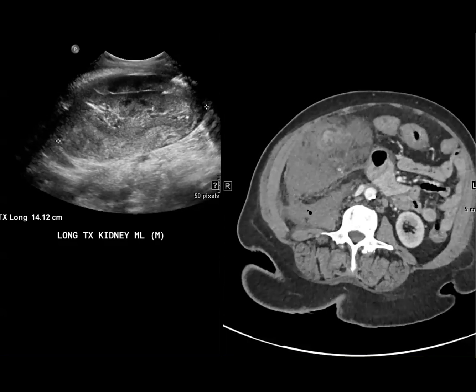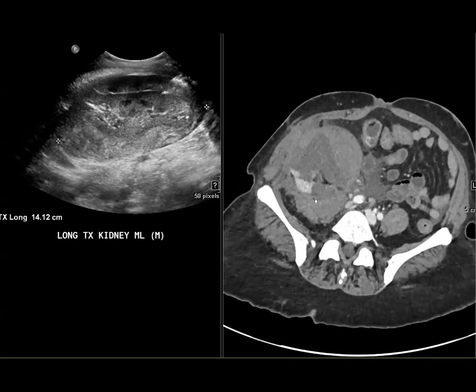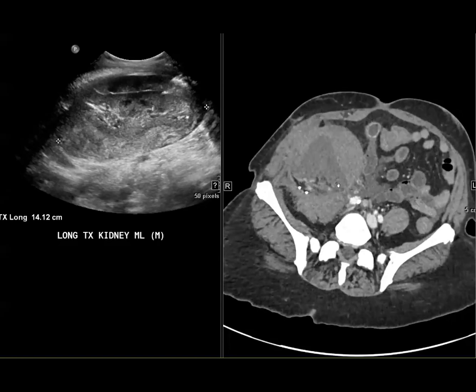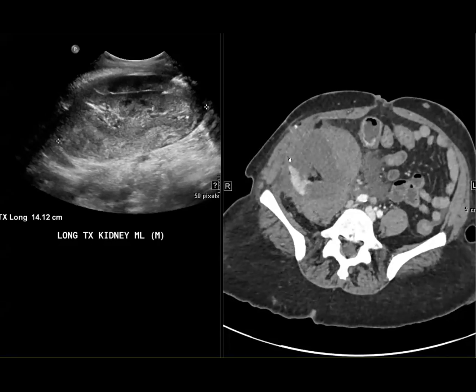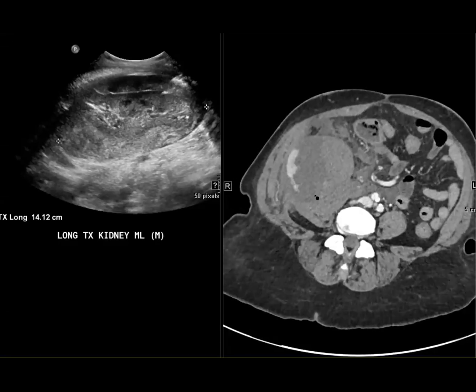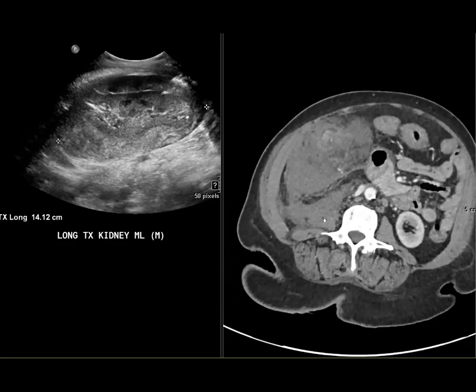So what I read was that renal transplants have a lower rate of getting Page kidney because a lot of times they cannot preserve the capsule when they're harvesting the donated kidney, and therefore if there is a subcapsular hemorrhage, it doesn't get trapped as acutely and as severely as in a native kidney. In this case, this transplant kidney looks like it had a mostly intact capsule, which is why the patient was getting hypertension, Page kidney. But then at some point, the capsule either was disrupted or had a disruption in it and was able to extend beyond it.